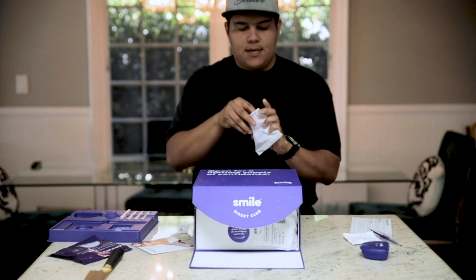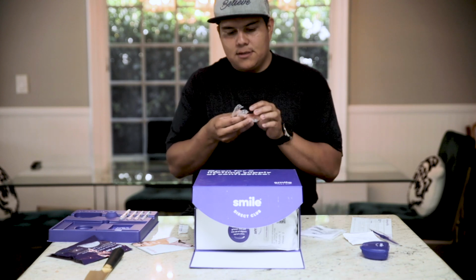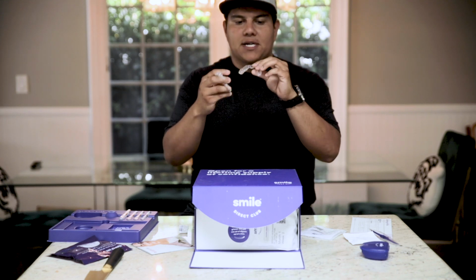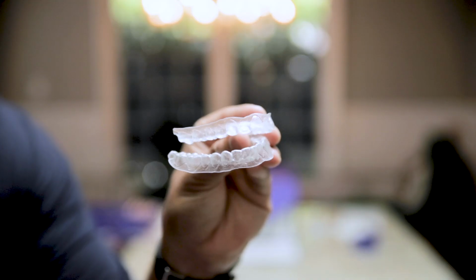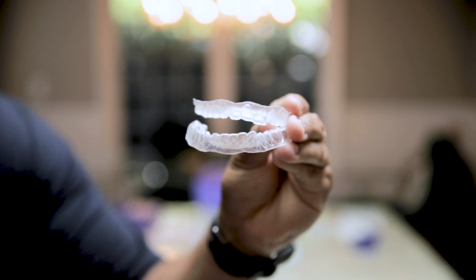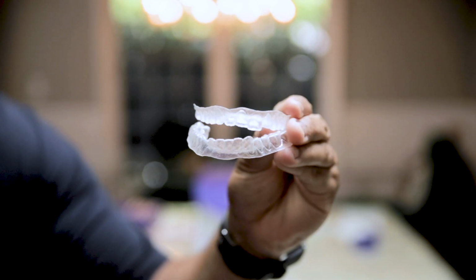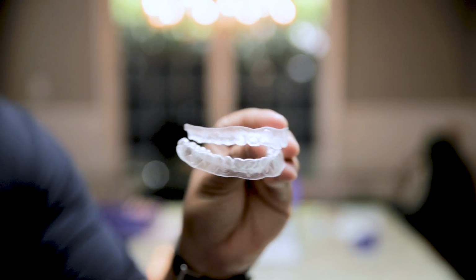All right, teeth are brushed, washed hands. Hopefully I don't do the reverse thing. So yeah, pretty much how my teeth look now, but I'm assuming it's a little bit shifted, obviously. So these are my first set right here. You can see my teeth basically look like this, but again, it is shifted a little bit because little by little they'll get straightened out. Top ones, bottom ones, so let's put them on.